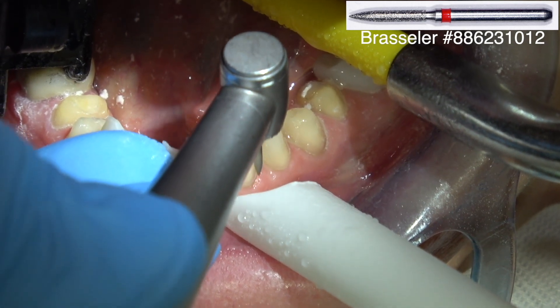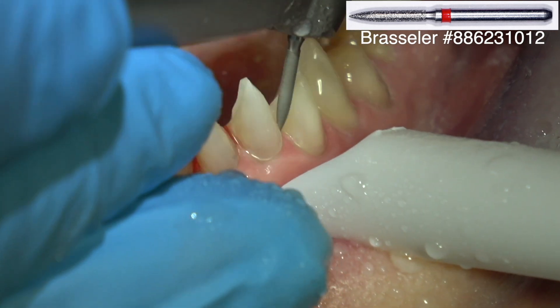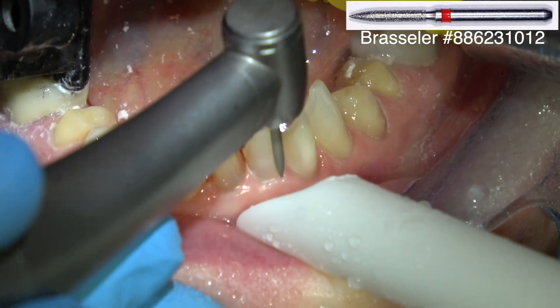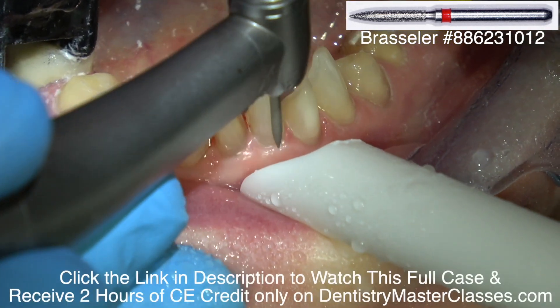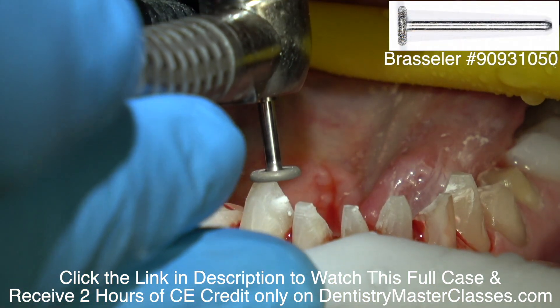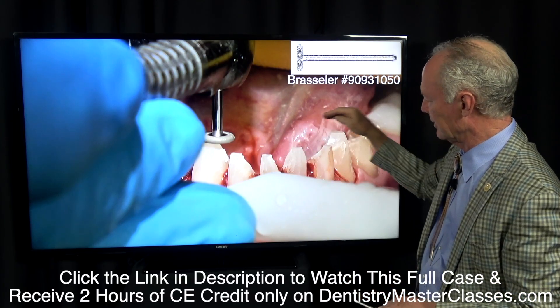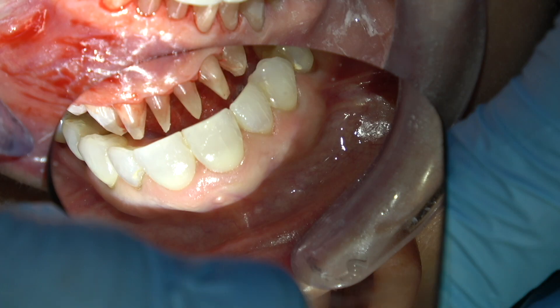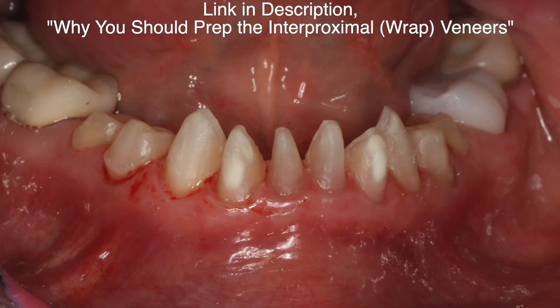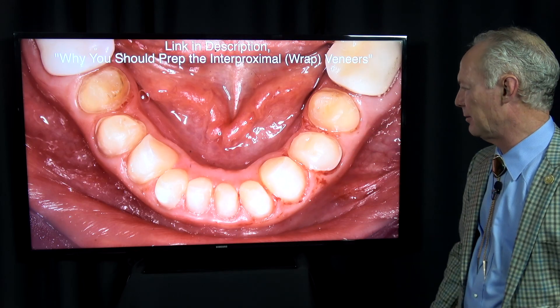Then I'm going to come back with a flame-shaped diamond once I've broken the interproximal contacts. I'm not trying to prep deeply into the tooth — about half a millimeter — and remember you've only got about three-tenths of a millimeter of enamel in the gingival one-fourth. The incisal preparation for veneers is flat; don't round the line angle on the lingual. I'm going to check the occlusal reduction — I've got about a millimeter and a half clearance. You can see how these were supragingival margins on the bicuspids.